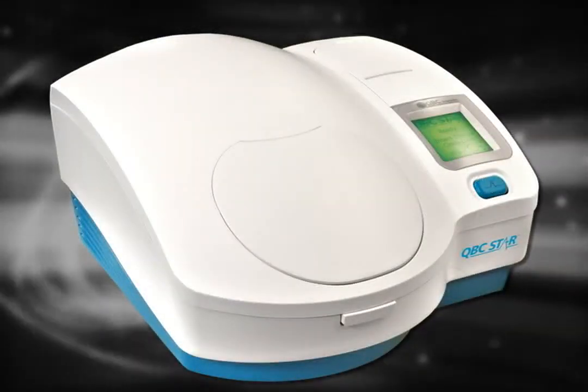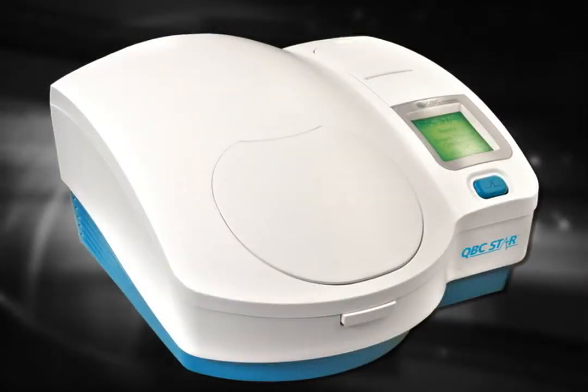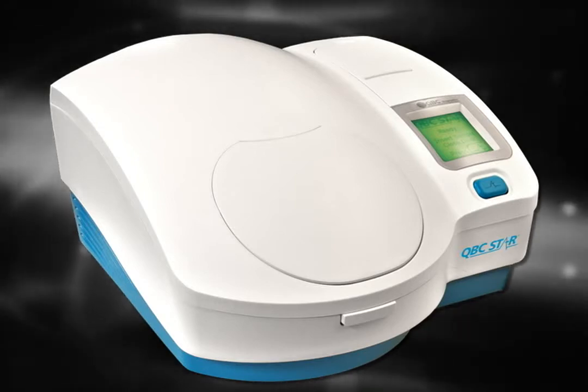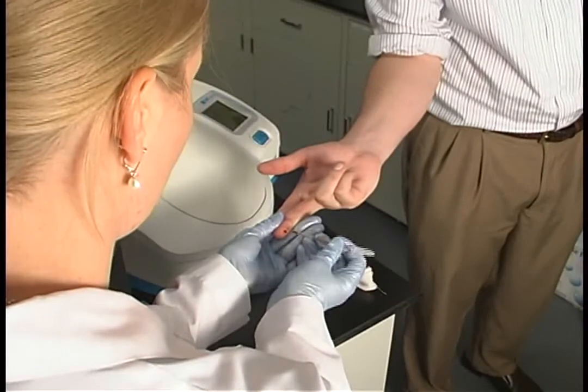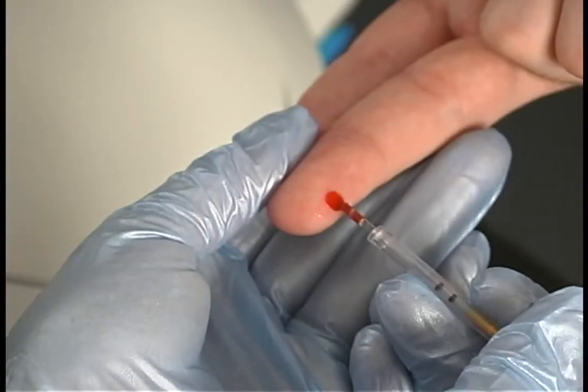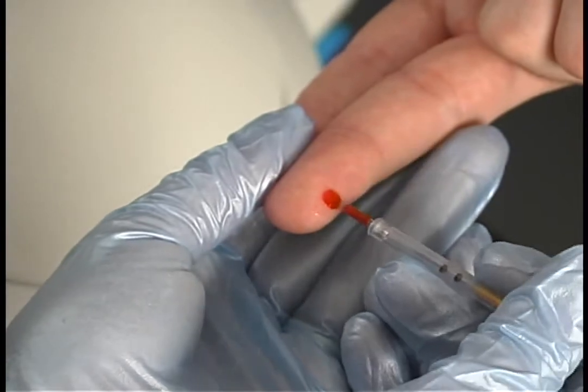The STAR system is a compact portable hematology analyzer that measures the parameters of a complete blood count using dry hematology technology. Patient samples are collected into a specially designed STAR tube, which is internally coated with all of the reagents necessary to perform a CBC. This innovation eliminates the use of bulky liquid reagents employed by other testing methodologies. It also greatly reduces the amount of waste involved in the testing process.